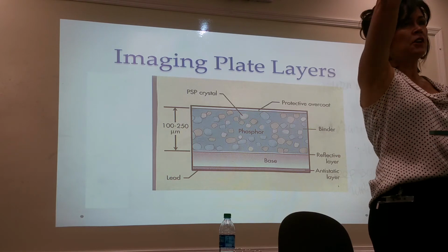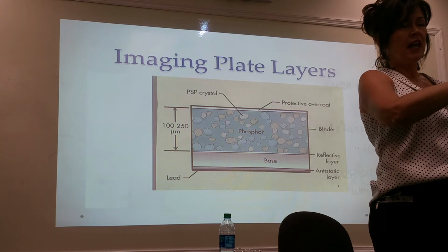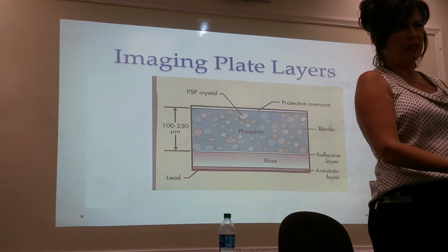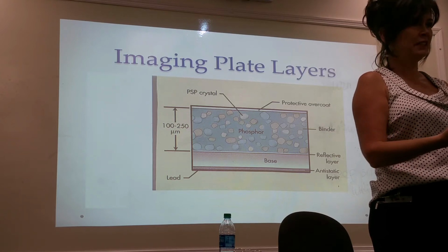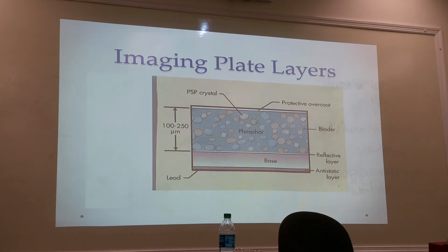So here the x-rays go through the patient, hit the imaging plate, and then, do they go through the imaging plate? Do x-rays go through an imaging plate? Absolutely. X-rays are very penetrating. Not all x-rays are absorbed by the phosphor and converted to light. Some will go straight on through and hit what's underneath, the Bucky tray, and it'll hit that high atomic number and backscatter.